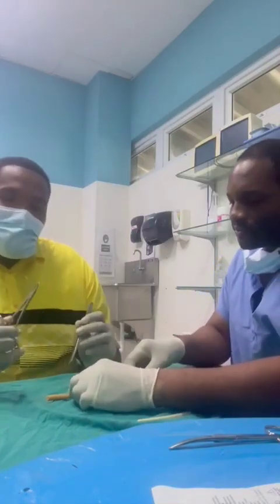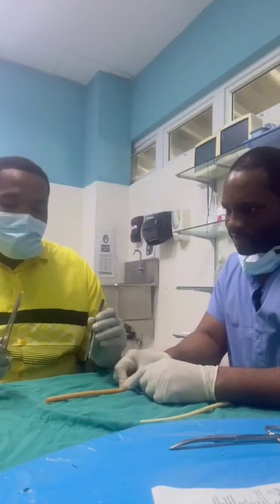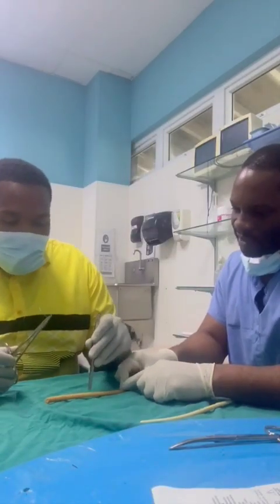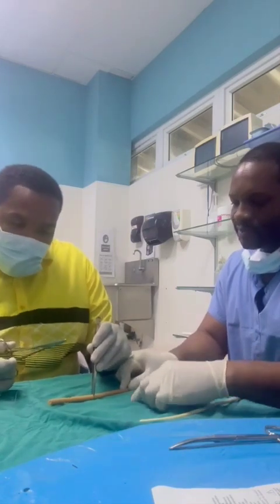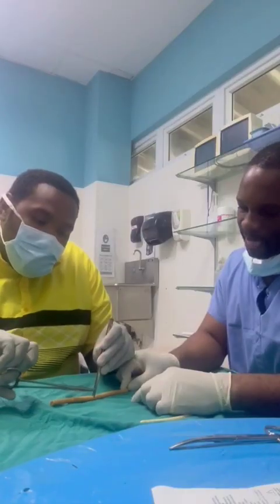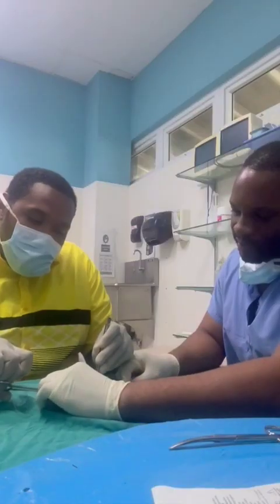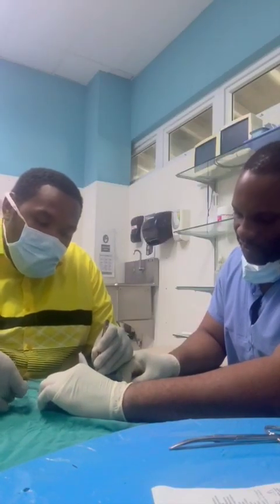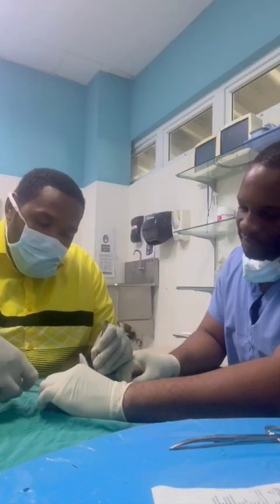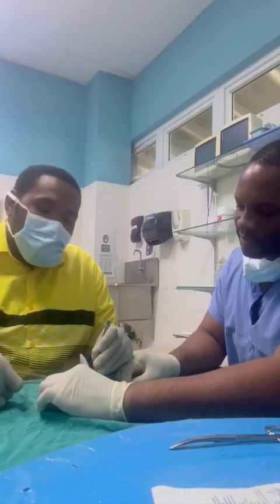Right, the interrupted. Alright, so first, I hold the needle at half and half. That's my preferred technique. I'll hold the tissue with the tissue forceps. I'll enter at 90 degrees. I'll go straight across. I'll rotate the wrist. Very good. Like this. And I'll bring back up the suture.